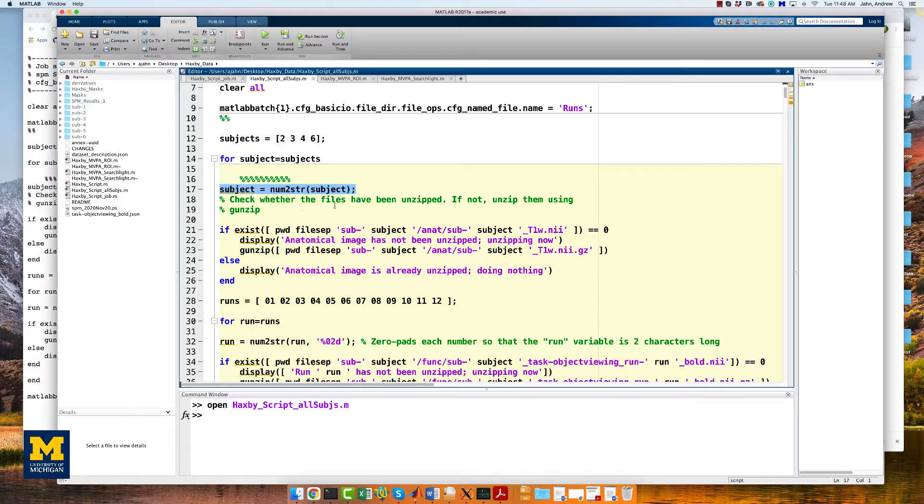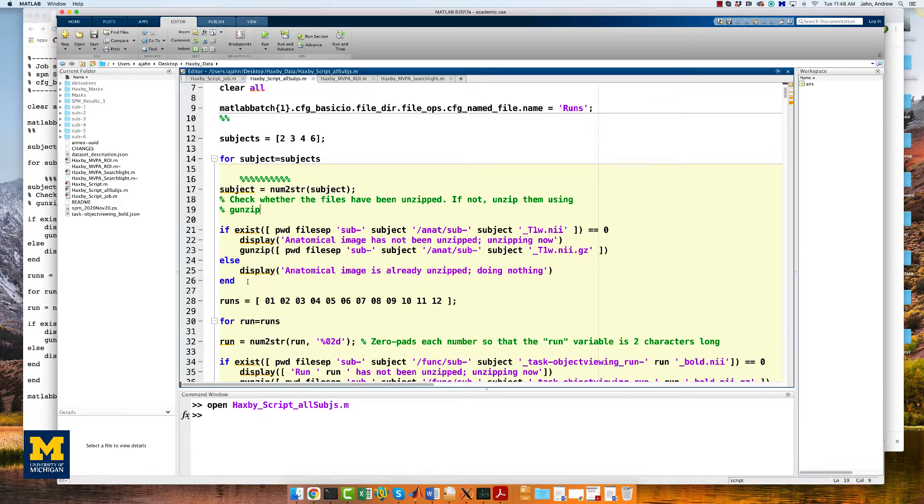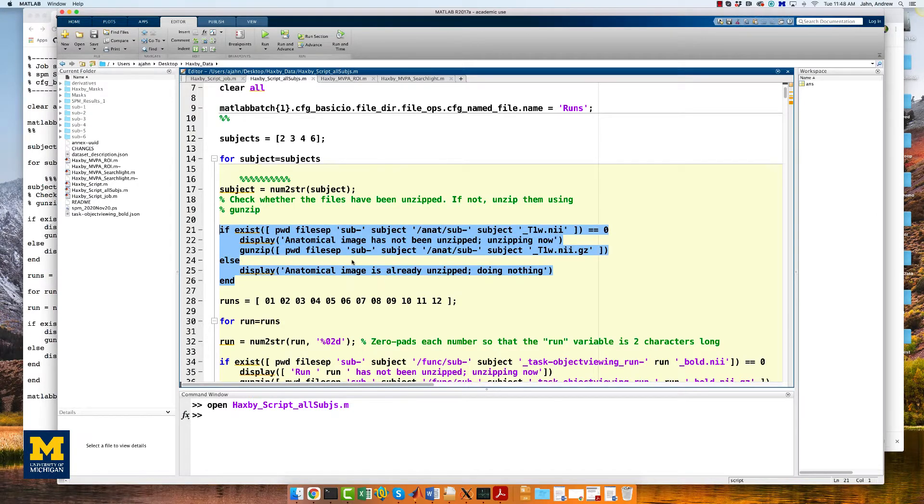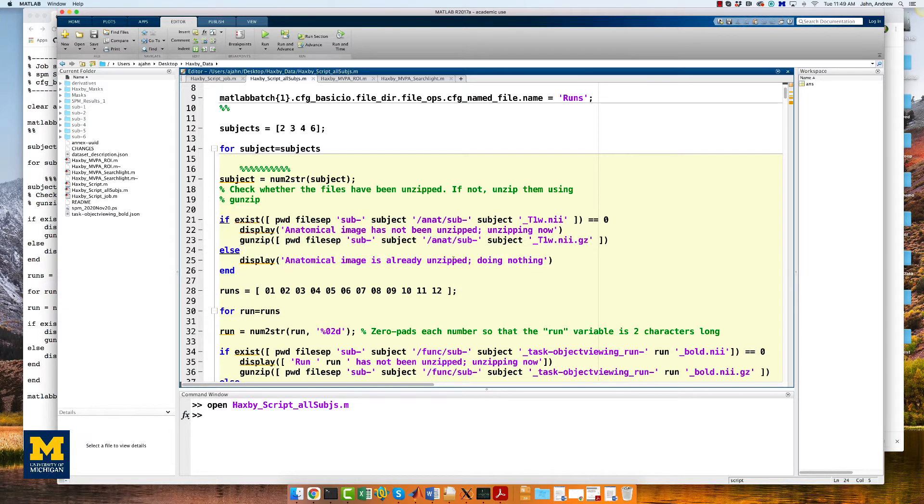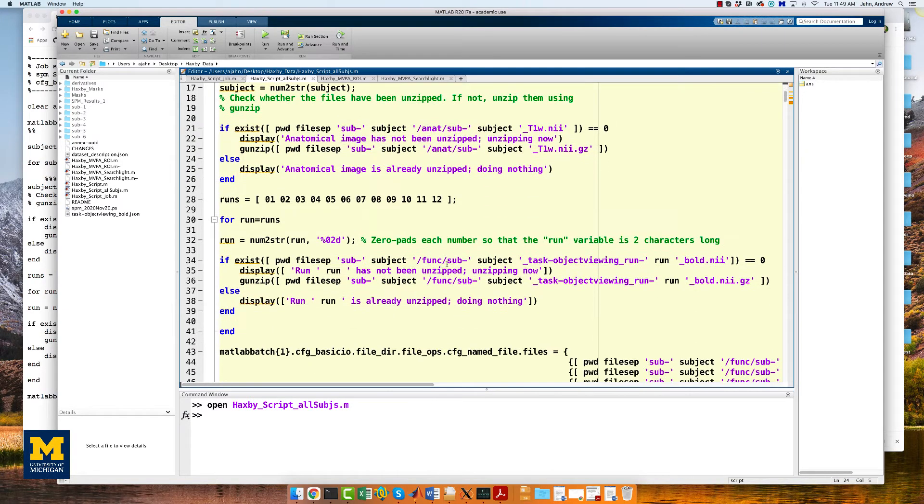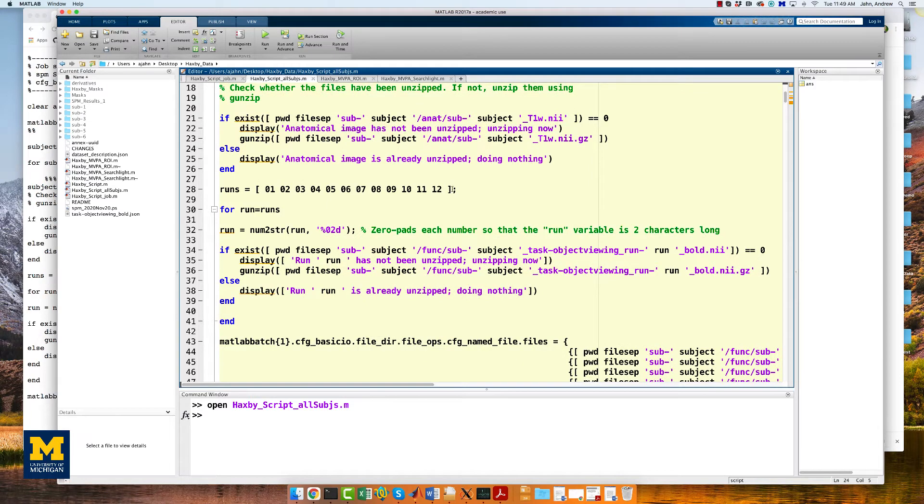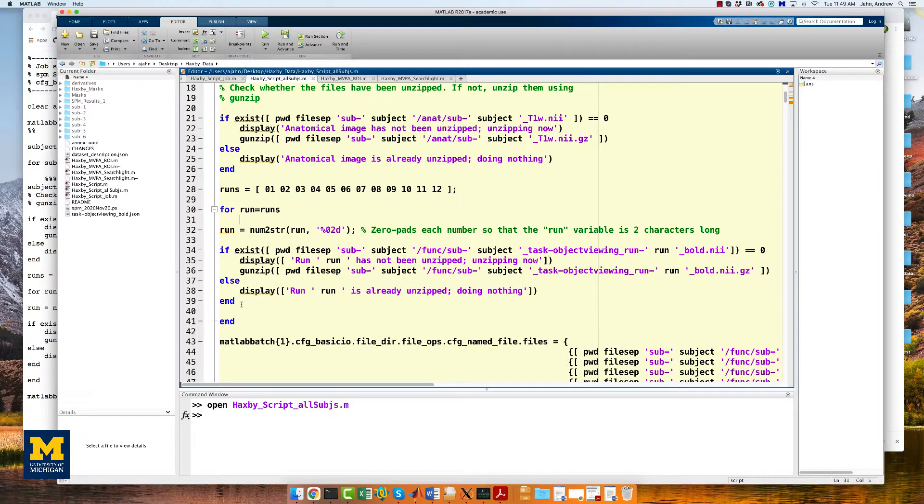We convert the subject variable to a string using num2string. And then we have a couple of if-else statements to check whether the anatomical image and the functional images are unzipped. If they're not, it will unzip it. If they already are unzipped, it'll do nothing. And we do the same thing for functional runs 1 through 12.